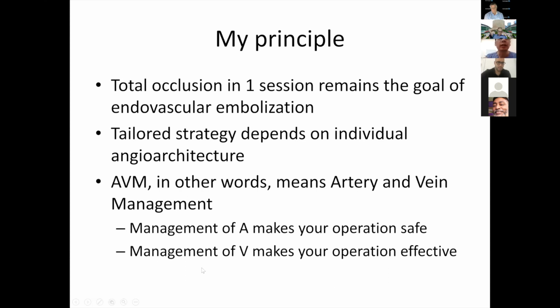The second, tailored strategy on embolization, is a tailored strategy depending on the individual angio architecture. The third, AVM, arteriovenous malformation, in my mind, means arterial and venous management.